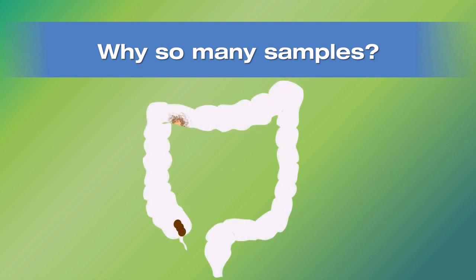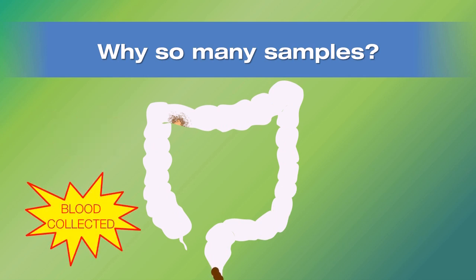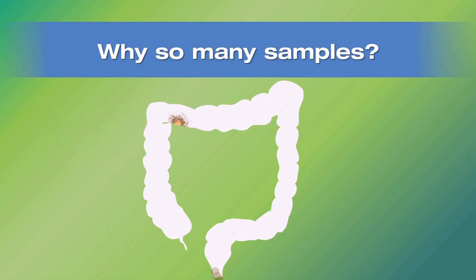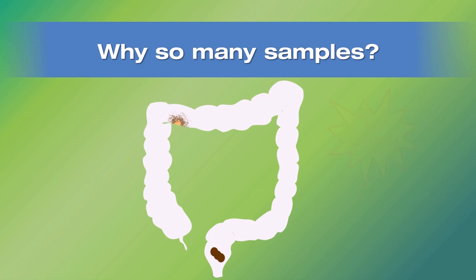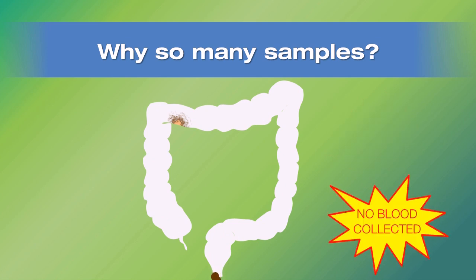The test is for blood that is not visible to the naked eye, or occult blood. The blood comes from the large polyps or from the colon cancers that are on the wall of your colon. As the colon pushes the poop out, the poop scrapes along the wall of the colon and picks up the blood from the cancer. But the colon changes shape all the time while it's working, so doing 3 sample days, each with a bit of poop from 2 different spots, increases the chances that we will find this invisible blood.